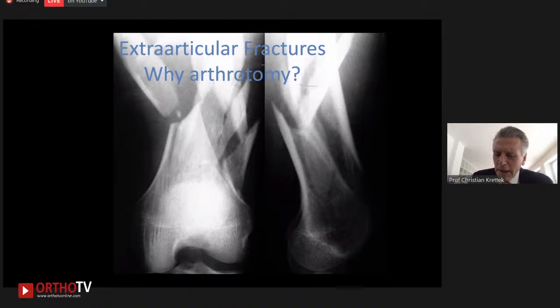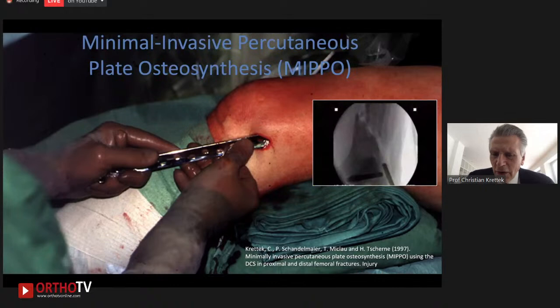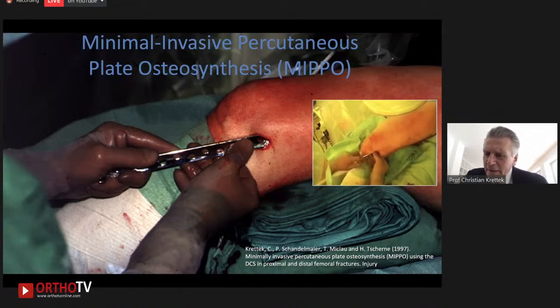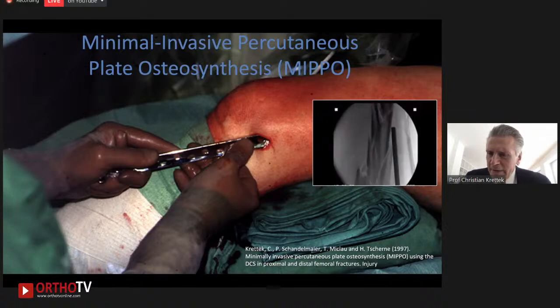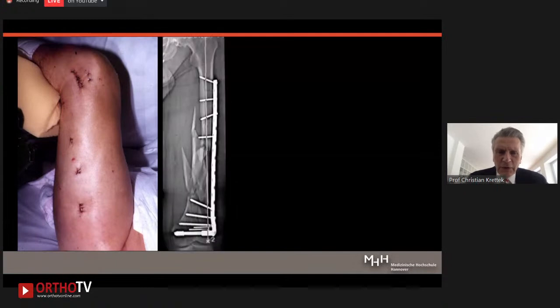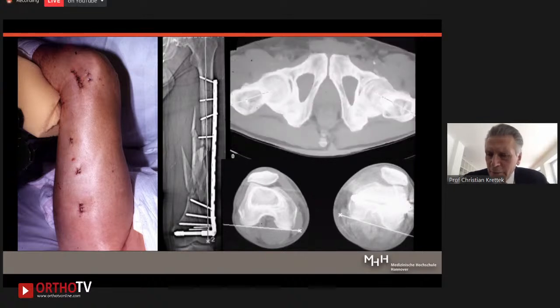We do not need an arthrotomy. Therefore, we can be very minimally invasive just by a short step type of incision on the lateral side, exactly projected to the center of the axis of the femoral shaft, and then the implant is inserted retrogradely beneath the vastus lateralis muscles, and with some techniques and tricks we will see in the second part of the presentation, we will achieve not only safe and reliable fixation, but also can avoid malalignment. So here's a postoperative course of this specific case, a small incision, long plate, and postoperative routine CT scan control in order to rule out and check if there is no malalignment, which has been proven here successfully.